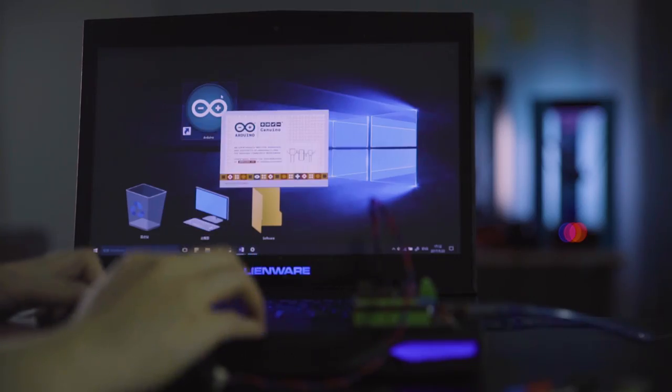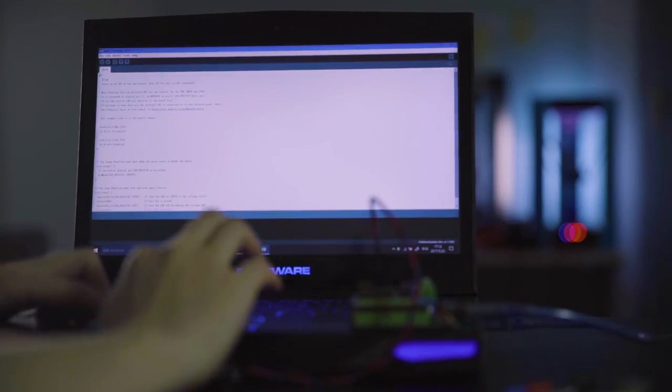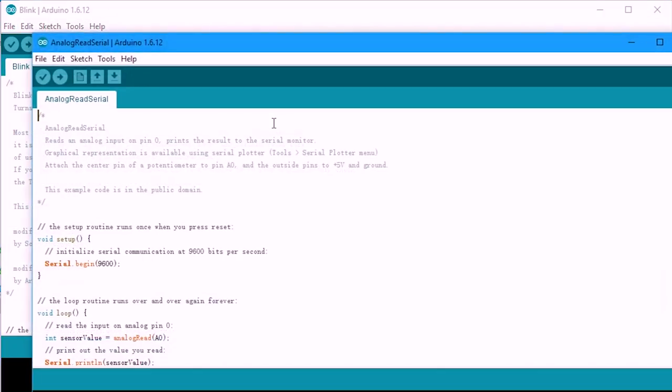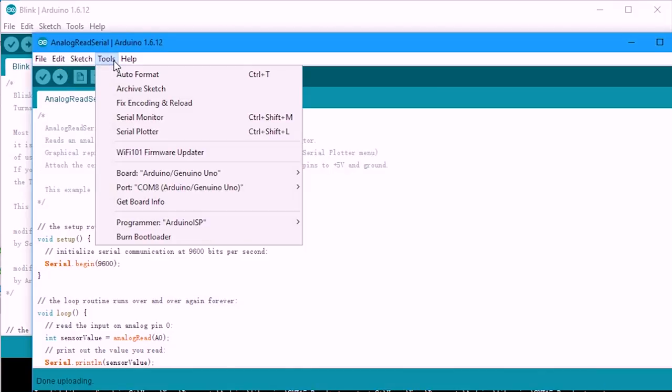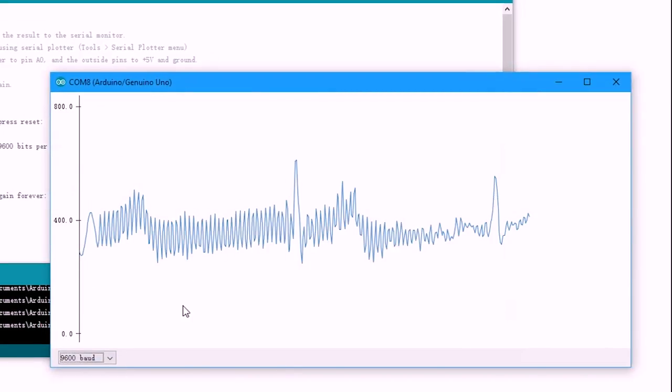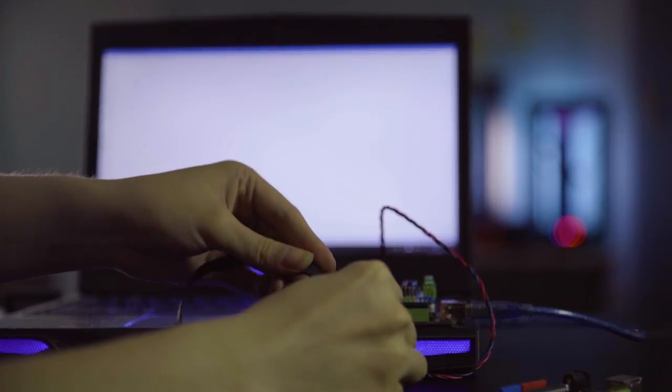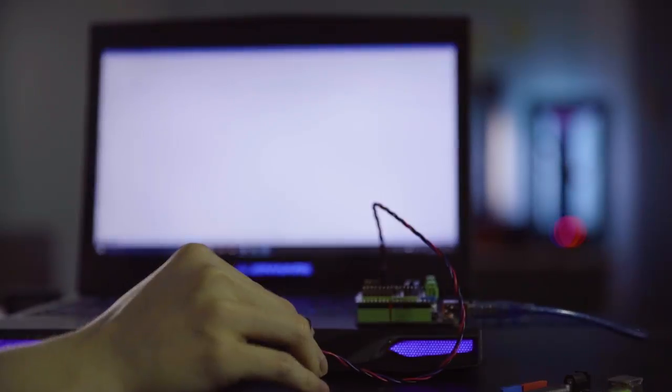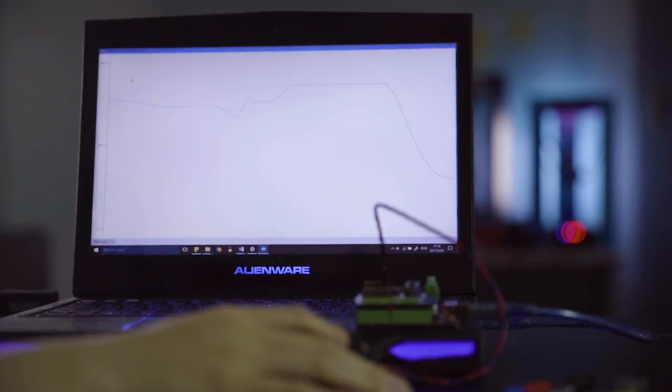Open the IDE, select the right board type and COM port, then go to Example, Analog, and open AnalogInOutSerial. Upload the code to the Arduino board. Once successfully uploaded, open the serial plotter. We will be able to see some random readings. Now put the sensor onto your finger or attach it to your skin, hold still, and wait for a few seconds. The heartbeat will be shown in the monitor.